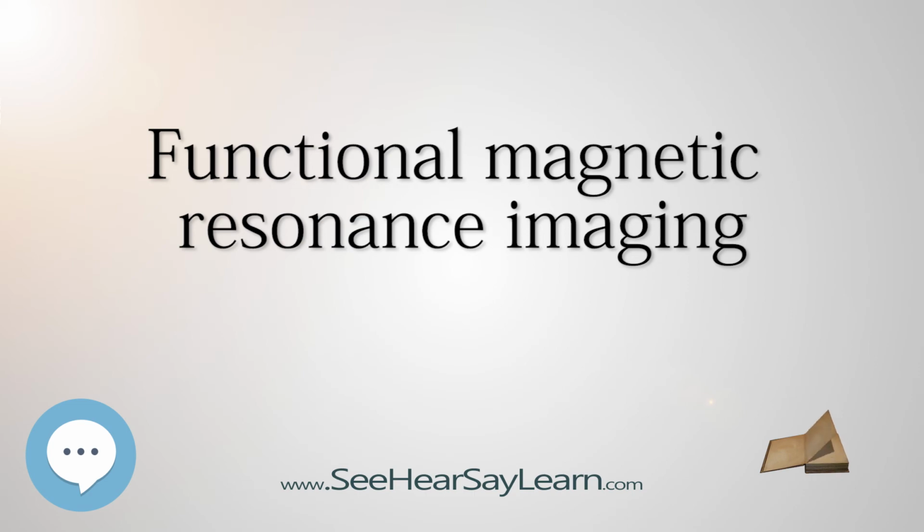System noise is from the imaging hardware. One form is scanner drift, caused by the superconducting magnet's field drifting over time. Another form is changes in the current or voltage distribution of the brain itself, inducing changes in the receiver coil and reducing its sensitivity. A procedure called impedance matching is used to bypass this inductance effect.